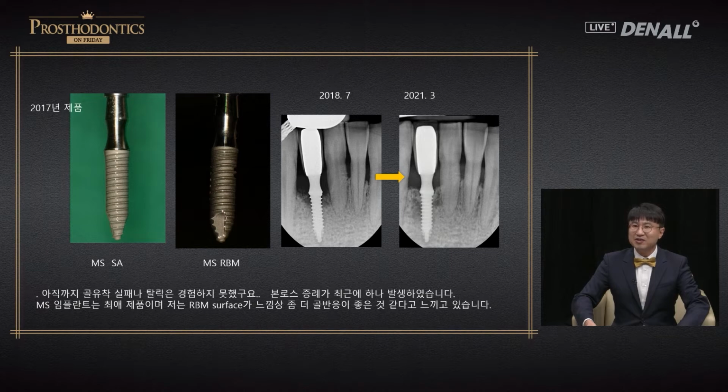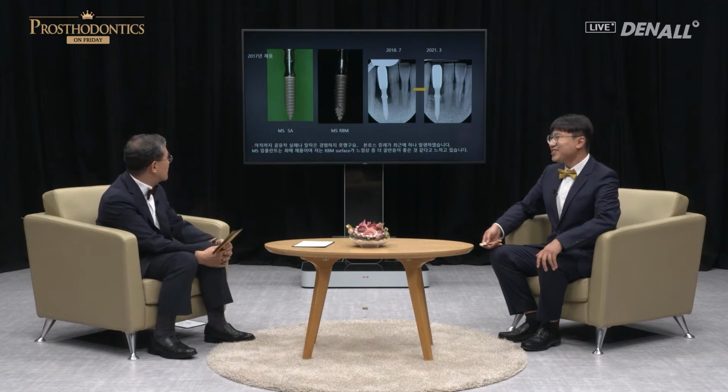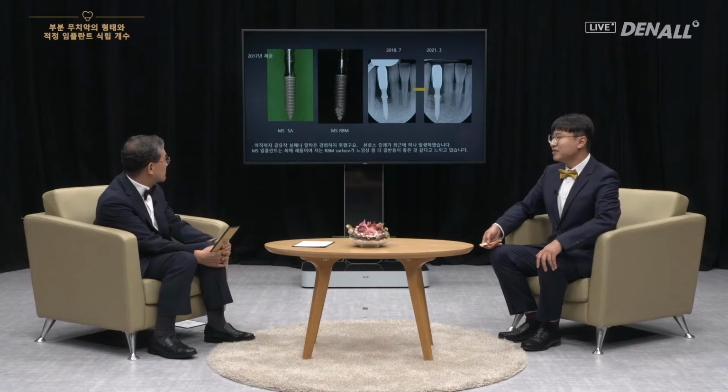Yes, I can see it's a very nice case using MS. I think I have asked my question too quickly. After 3 years, you can see that bone fill is made very nicely. MS implant is a very nice implant. Yes, I can see that there's a lot of bone fill.